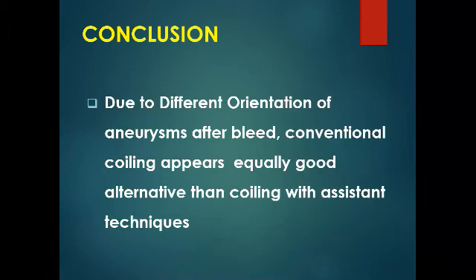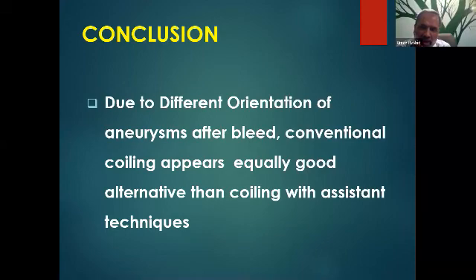Let me ask you the question another way. If you have a patient with a non-ruptured aneurysm, 8 millimeters, and you want to treat, and the patient has only headaches, do you also use a simple coiling technique, or do you shift in those patients to stent-assisted or balloon-assisted techniques because the patient is non-ruptured? Okay, you're right, but in fact, this can be done. We give an option to the patient, but I share my opinion with the patient. Look, I'm quite comfortable doing simple coiling if I properly assess the aneurysm architecture. So generally, we do simple coiling.